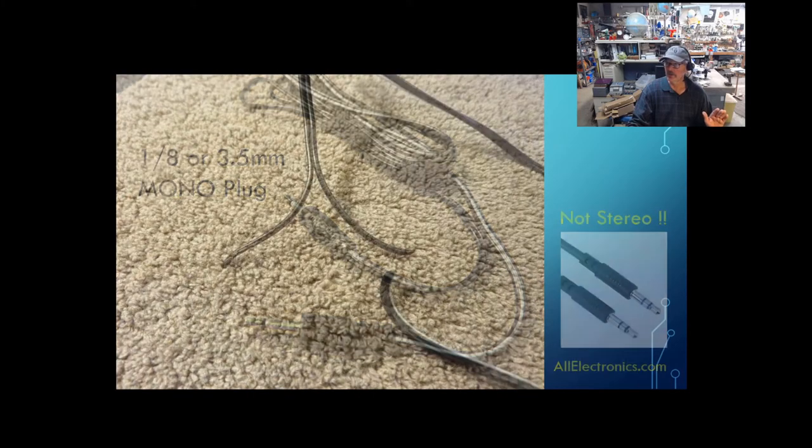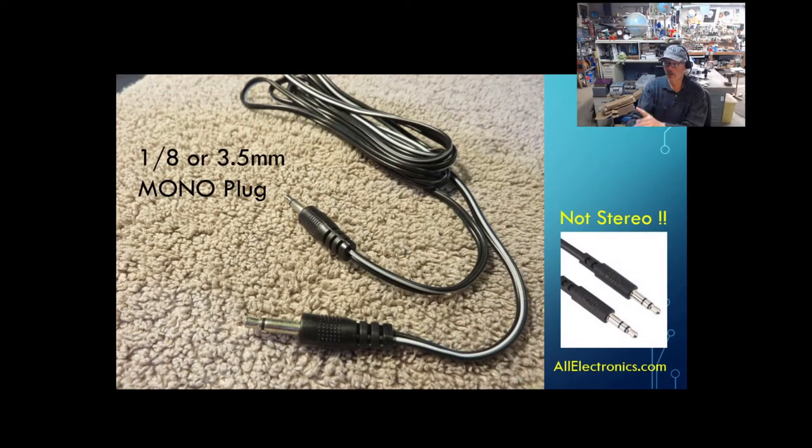So you're going to need a 1/8 inch or 3.5 millimeter mono plug. And mono, if you look at the connectors, you're going to see two metal connectors where it plugs in. That's a mono plug. That's what you want. What you don't want is the three connectors. That'd be stereo, and they will not work. Stereo is like ground, channel right, and channel left. Don't use it. Just the mono.